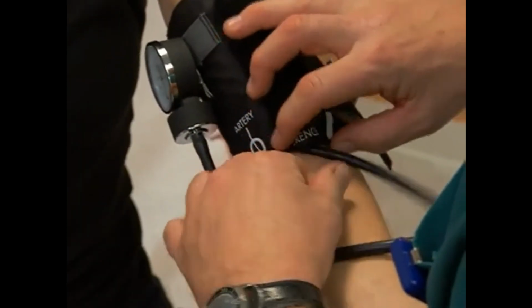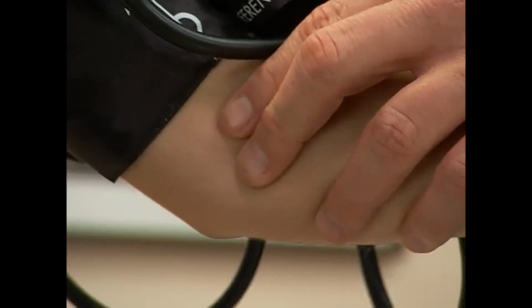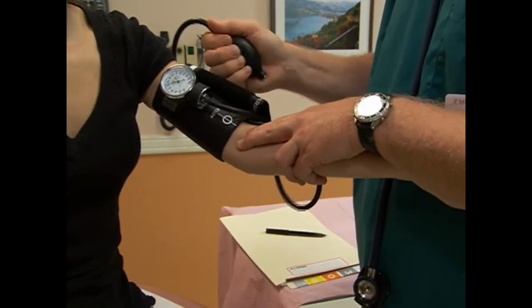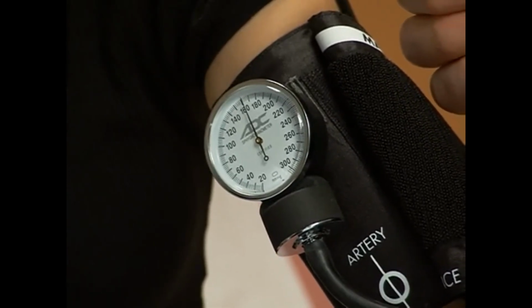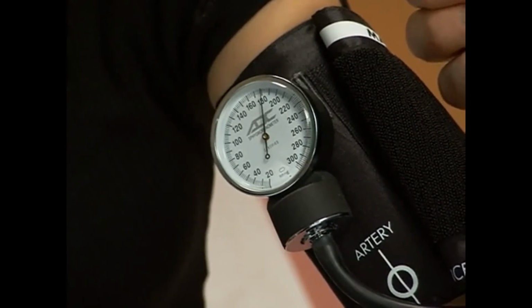diaphragm of the stethoscope. While palpating the brachial or radial artery, inflate the cuff by pumping the inflator bulb until the pulsation disappears. Immediately note the reading on the gauge. Then continue to inflate the cuff to 20 millimeters of mercury above the point where the pulsation disappeared.